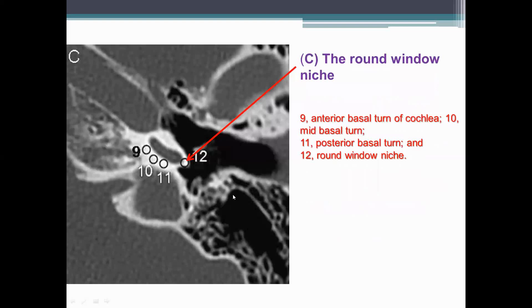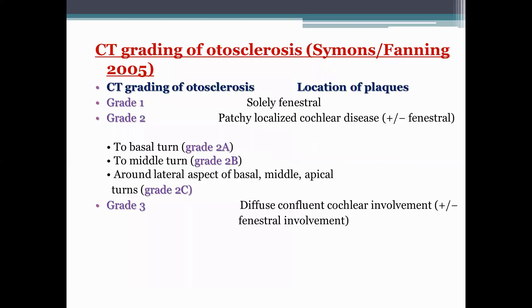The next area of interest is at the level of the round window niche. Area 9 is the anterior basal turn of the cochlea, area 10 is the medial basal turn, and area 11 is the posterior basal turn of the cochlea. Area 12 is the round window niche. These three levels are the key areas to examine when looking for otosclerotic foci in the CT scan of the temporal bone.